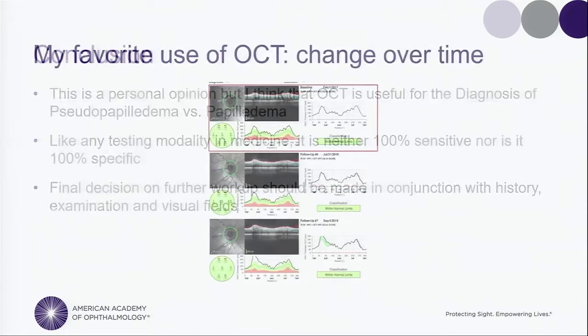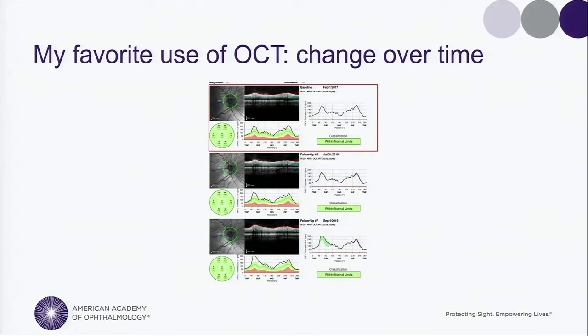My favorite part about OCT is follow-up over time. This is a child with papilledema who was sent to me, and I thought he had pseudopapilledema. When I stopped his Diamox, he actually swelled back up, so I put him back on the Diamox. So there are little tricks that you have to combine: evolution over time, the rest of the history, and the examination to make that decision. But it is useful. It's not mandatory, and it's not 100% sensitive. Thank you.